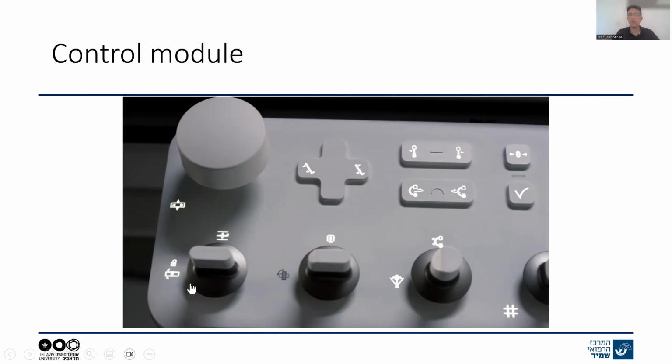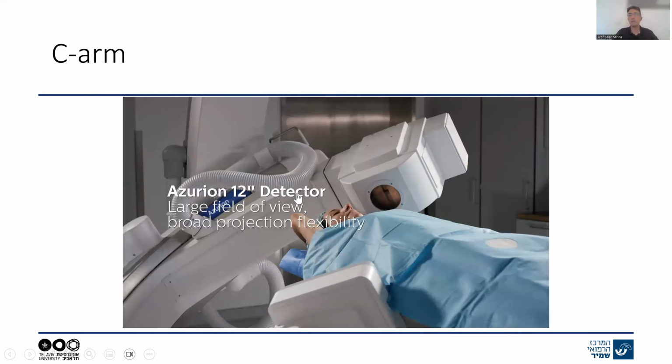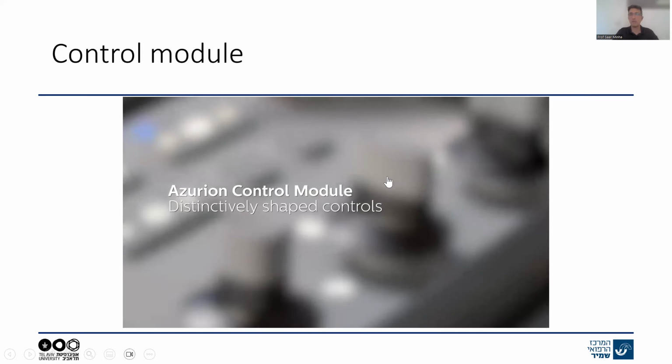And one important feature that Philips added, and we use frequently as needed, is the tilt of the table. Remember that we are treating sick patients, and at times, God forbid, they crash, and we need to go to a resuscitation session. So let's just imagine, if we go backwards, that the patient is within this C-arm, and anesthesiologists and other team members from the CCU are coming to help us. If the patient is sitting within the C-arm, it will be impossible to assist him and start resuscitation.